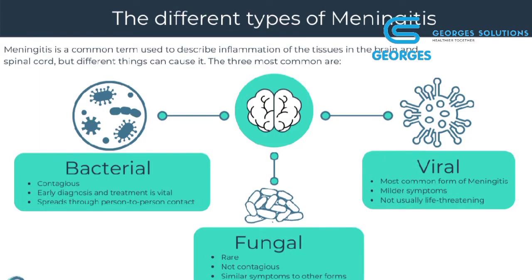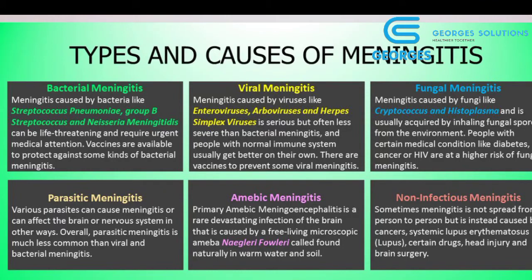And a mixed reaction such as neutrophils, lymphocytes, and monocytes is seen in subacute bacterial meningitis, tuberculous meningitis, mycotic meningitis, and viral meningoencephalitis. Monocytic and lymphocytic reactions are seen in viral meningitis, multiple sclerosis, tuberculous meningitis, fungal meningitis, and syphilitic meningitis.